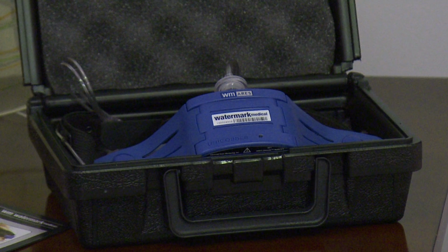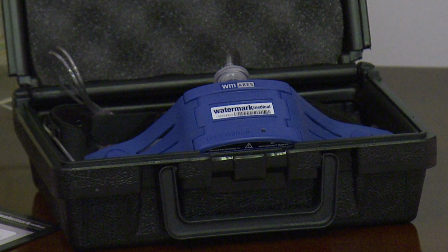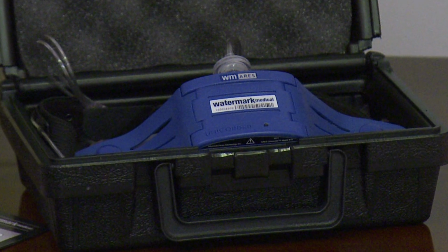And so it's a quick, simple, easy way to just get this done. This will replace overnight studies eventually, we think, just because the compliance is so much better. There's not as much artifact. Artifact is where you go into the hospital and you can't sleep because it's not your bed, the room's not the same as you usually have it, and you don't sleep very well anyway. When you're in your own bed and you're in a position where you're not overly wired and overly observed, you get a better, more realistic idea of what you did during the night.